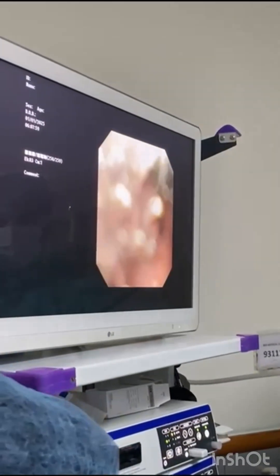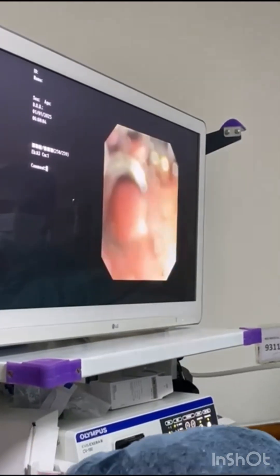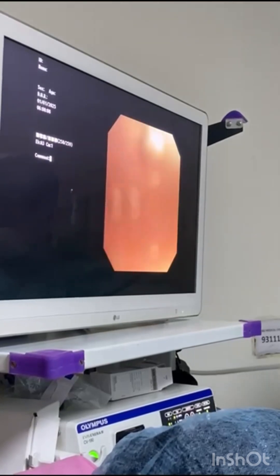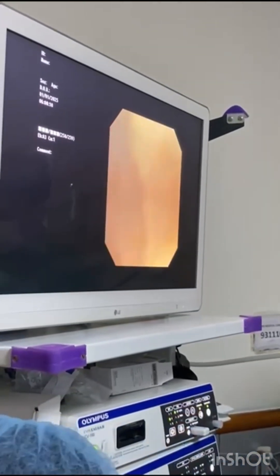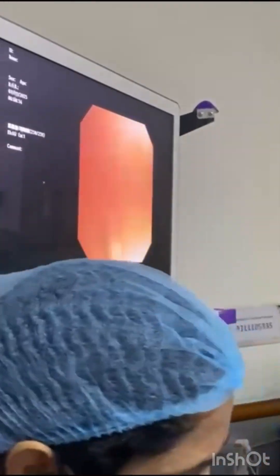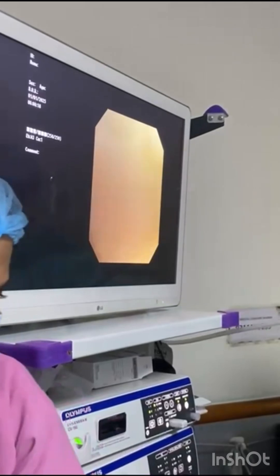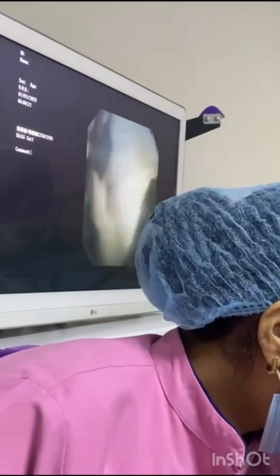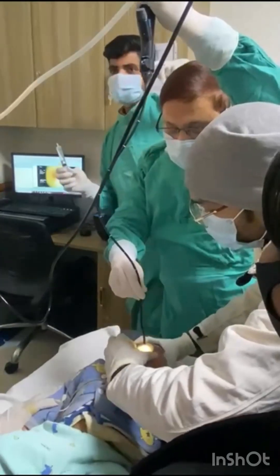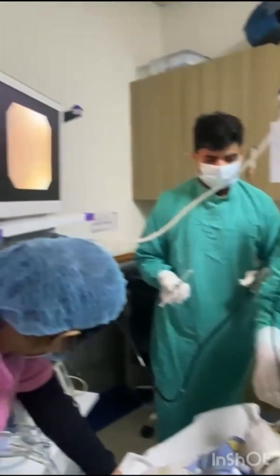This is abnormal. The epiglottis, which is the covering of the glottis, is abnormal in this child, and it is responsible for laryngomalacia, stridor, and noisy breathing. It is now clear that the cause of stridor and noisy breathing is laryngomalacia.